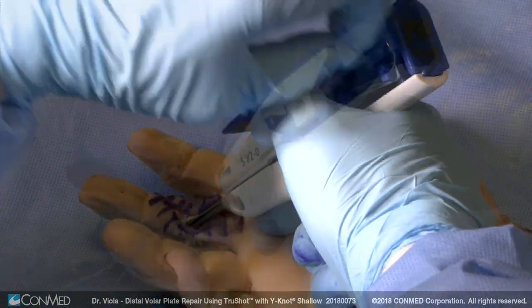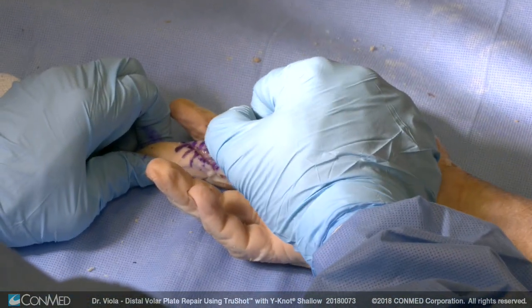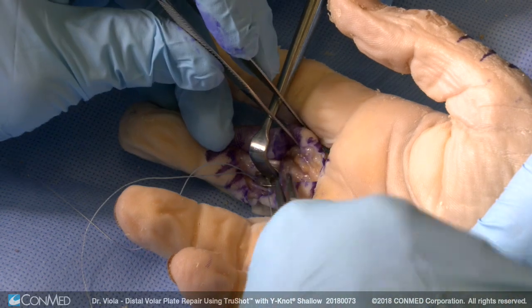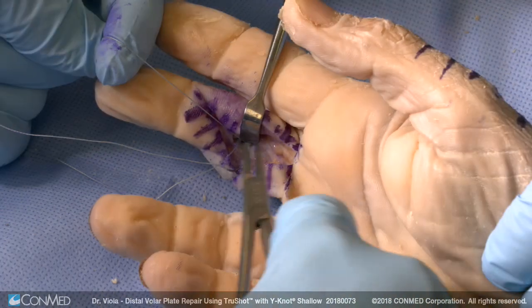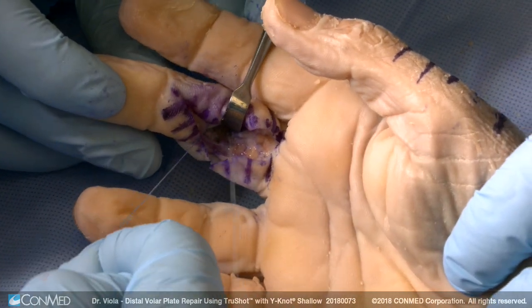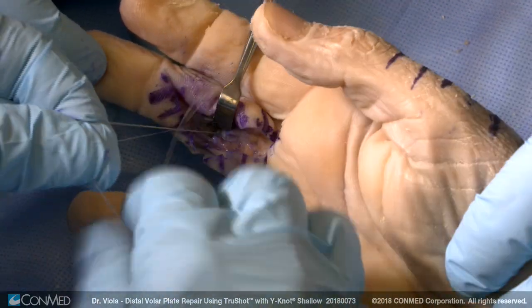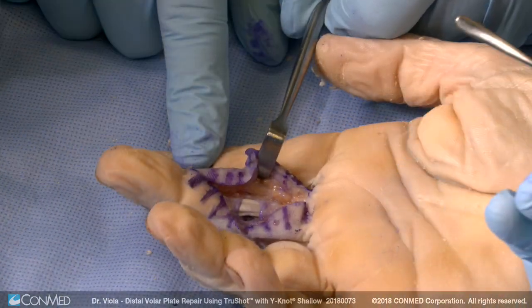We remove the sutures from the middle phalanx — the attachment of the volar plate. The suture slides. Now we retract both of the flexor tendons. One limb of the suture anchor is passed through the distal aspect of the volar plate; the other limb is left free. That second limb is tensioned and the volar plate is advanced to its normal insertional site. The surgical assistant positions the PIP joint at the desired position of maximal extension — I usually choose 15 degrees. The sutures are then tied and the volar plate is repaired.